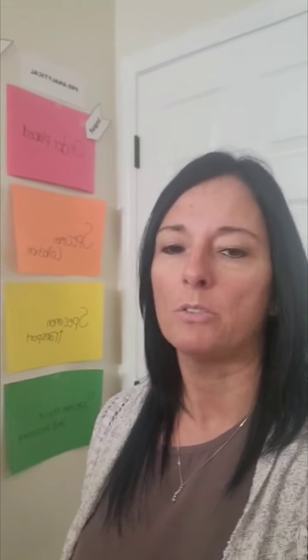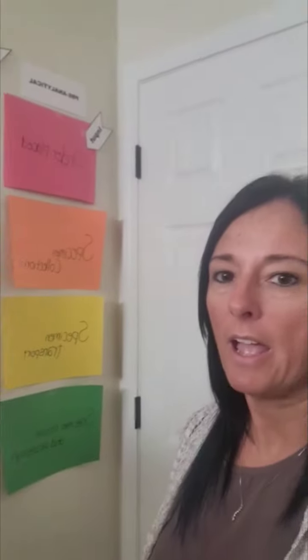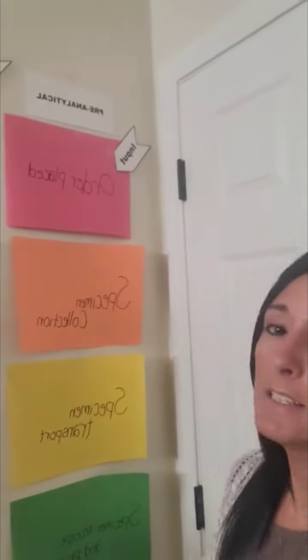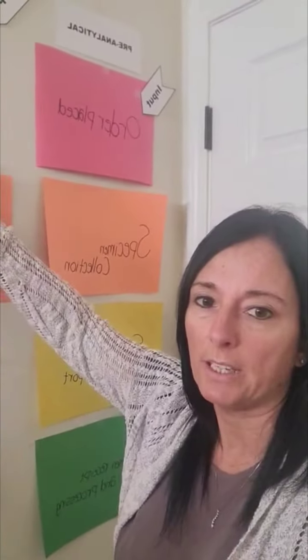By. But anyway, today I'm going to talk to you about the mapping process for the lab flow procedures in my laboratory. So here I have, when a patient comes in to see a provider, an order is placed. And the order is placed for this particular patient, we're going to go with the CMP.